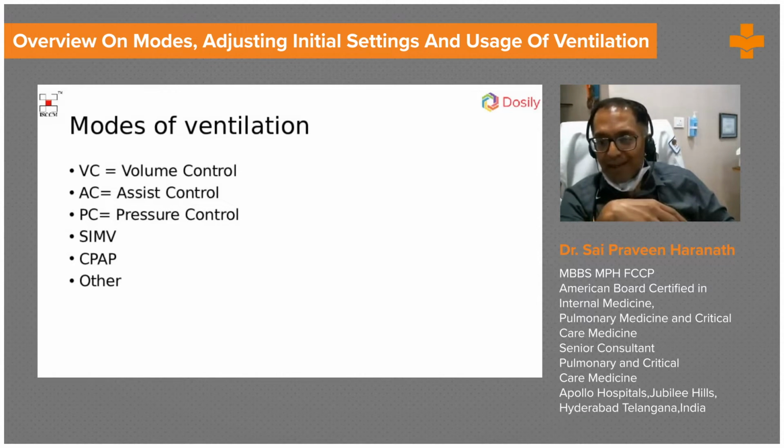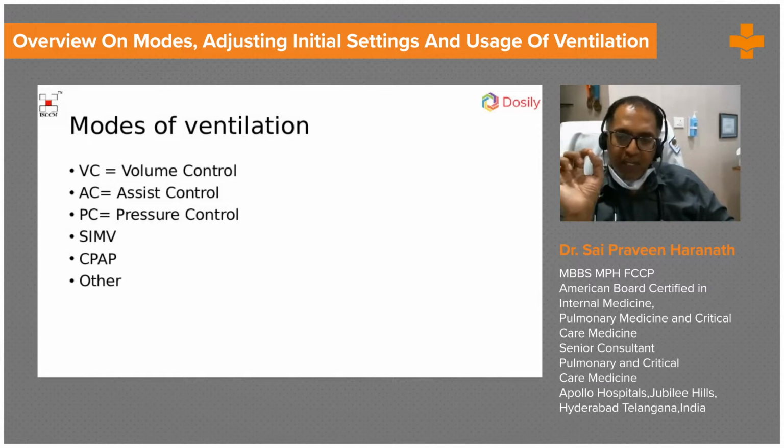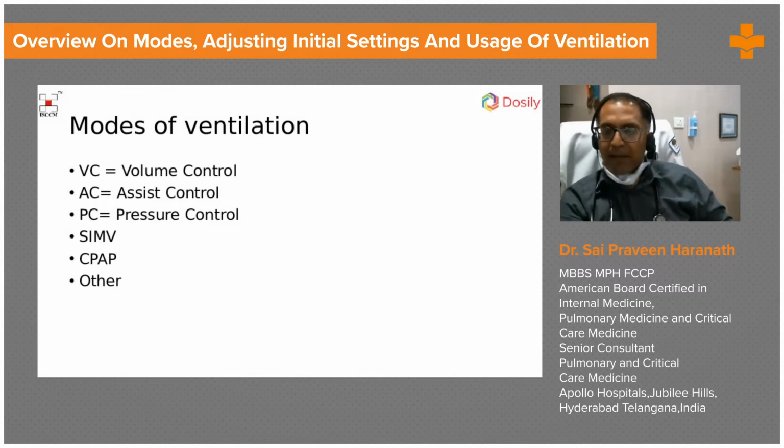And this actually is very high tech, in the sense that there are pressure gauges in these ventilators, in the pipes, and these pressure gauges are measuring the pressure. So when you take a breath in, when you suck the air in, the pressure drops a bit and the machine knows somebody is asking for a breath. It is checking that number several hundred times in a minute, and then it is ready to give the breath to the patient. You could also have a situation where you want to take a really deep breath, and then the machine can also give you a deeper breath.